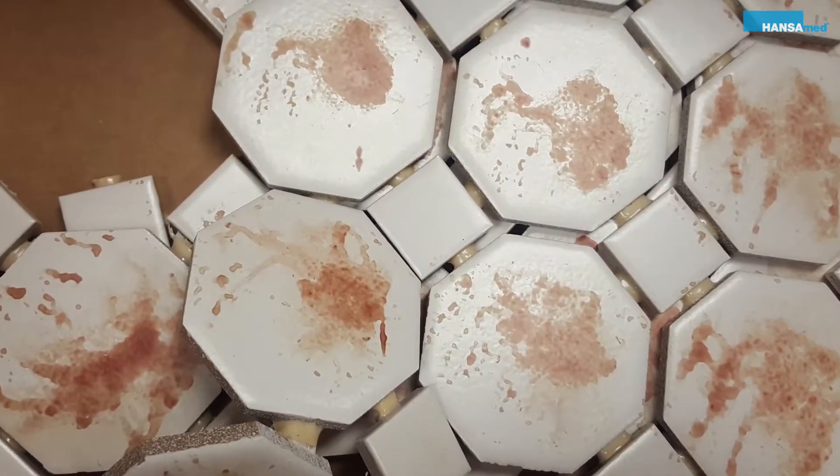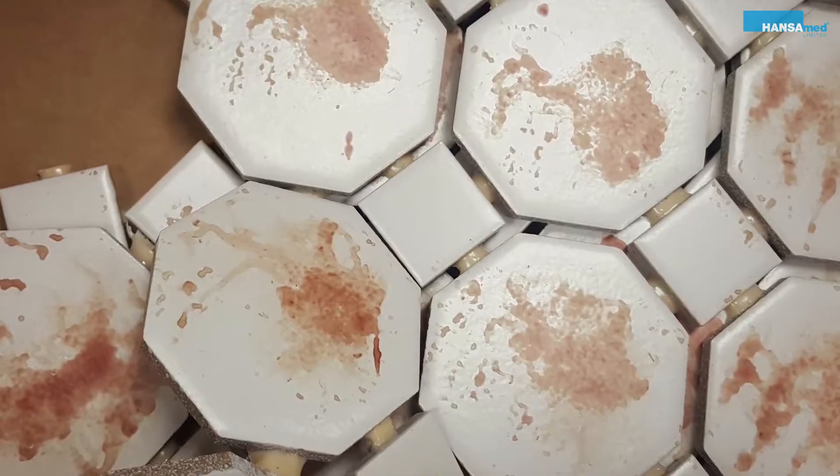Today I'm conducting a cleaning efficacy test. This test measures a disinfectant's ability on environmental surfaces. These environmental surfaces will be covered in dried organic debris. Today we are testing the ability to remove protein from these contaminated environmental surfaces.